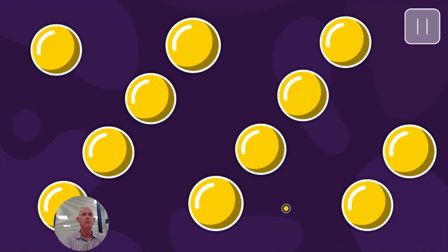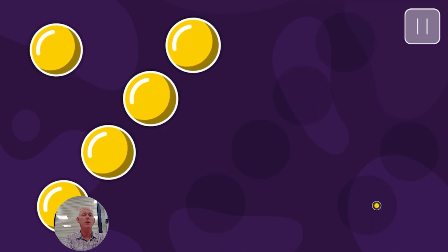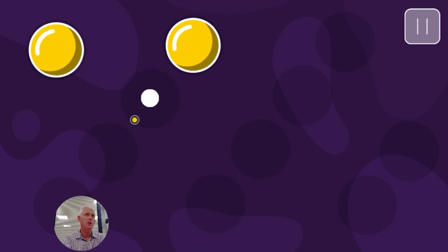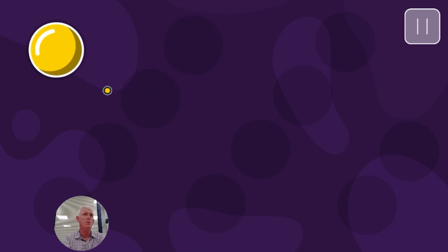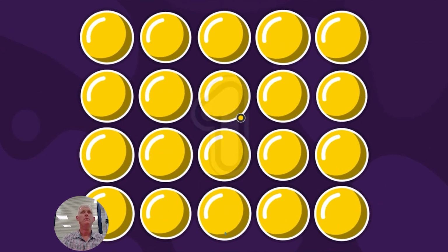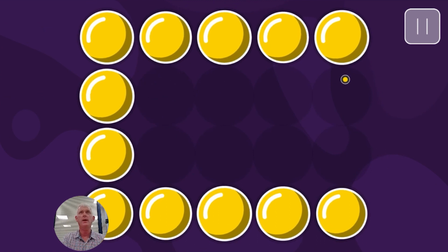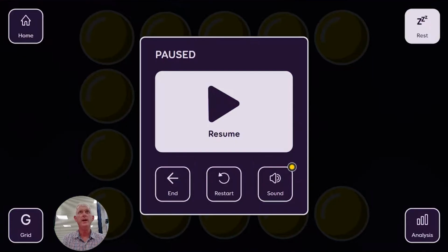Okay, no fail, just explore, encourage to look all the way around the screen. Are we missing anywhere? We might need to help. We might need to pop a bubble. We might need to think and make a note to ourselves that perhaps he struggles a little bit with that top left area. And so on.